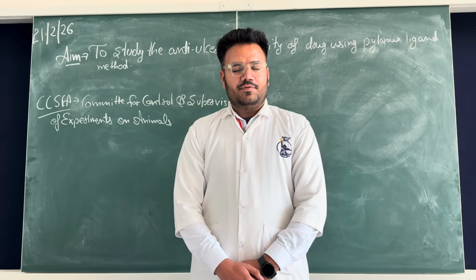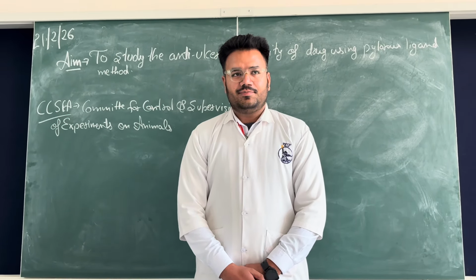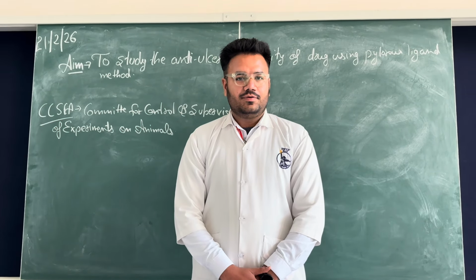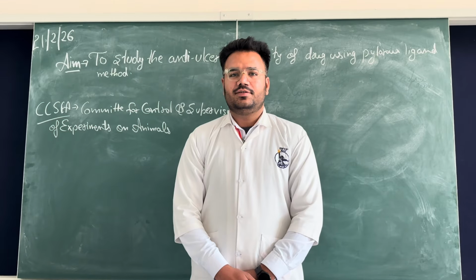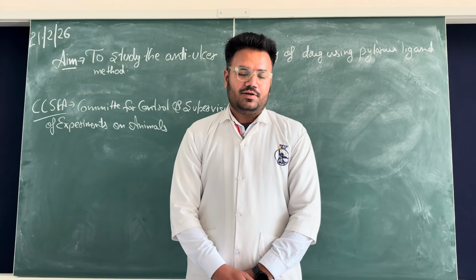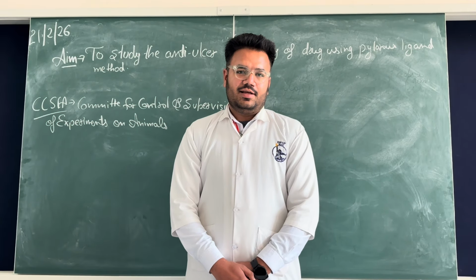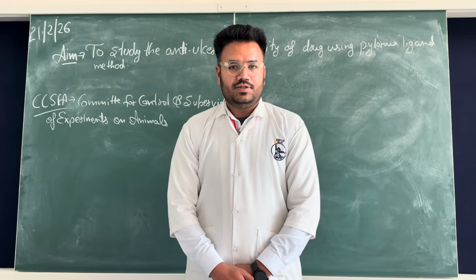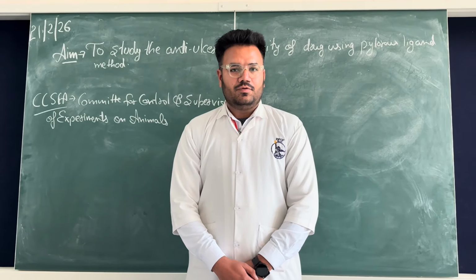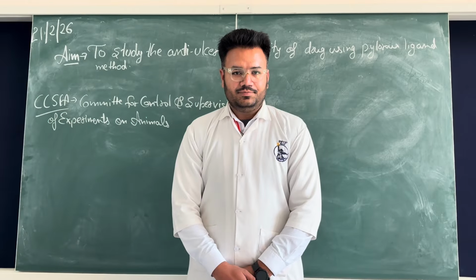And today I am here for the practical demonstration for the B.Pharm 6th semester students for Pharmacology 3. The subject code of this practical session is BP608P. Today we will discuss the virtual experiment demonstration, that is to study the anti-ulcer activity of a drug using the pylorus ligation method. In this method, we will ligate the pylorus part of the stomach.